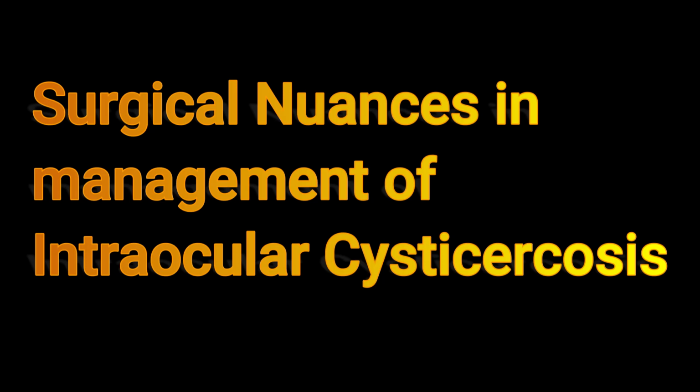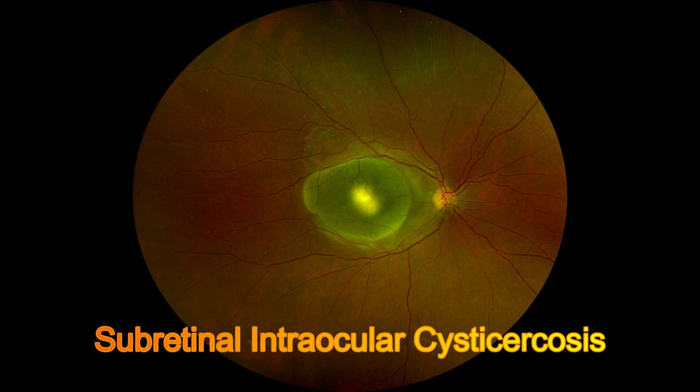In the following video, we will discuss the surgical nuances in management of intraocular cysticercosis. Our first patient is a 56-year-old who presented with history of seizures and on neuroimaging was diagnosed with neurocysticercosis. Dilated fundus examination of his right eye revealed the following picture.